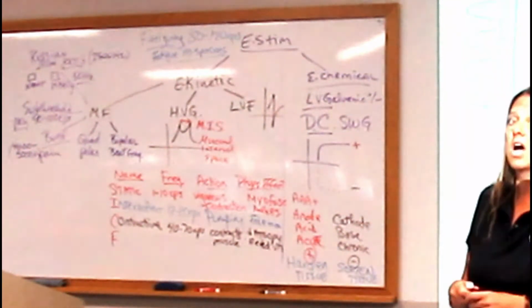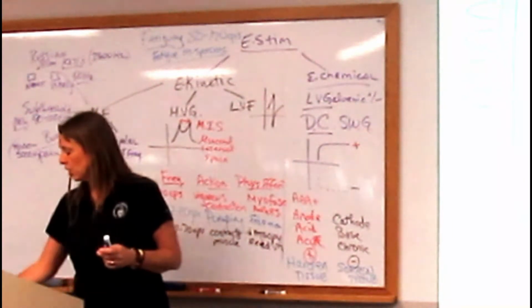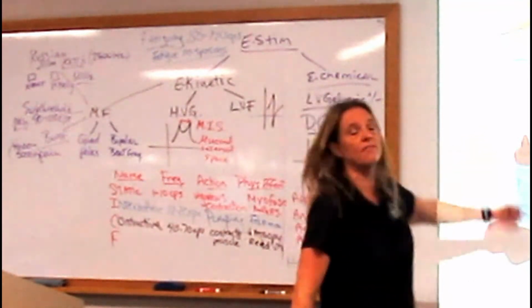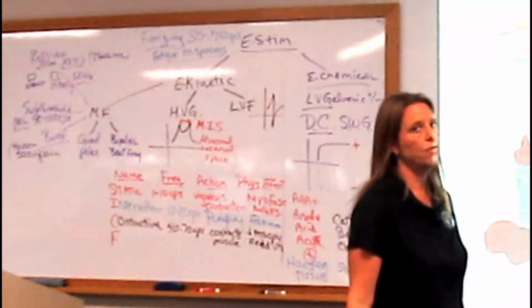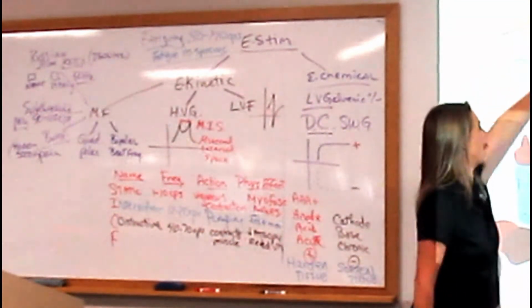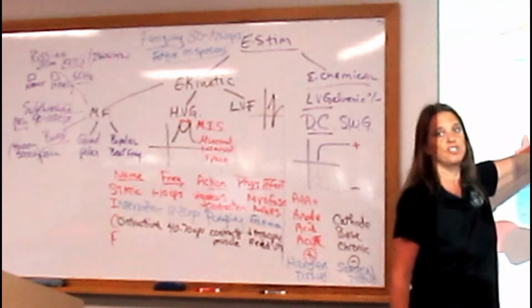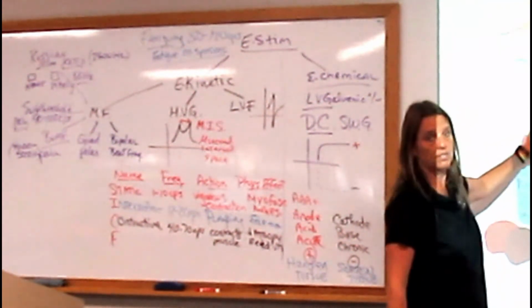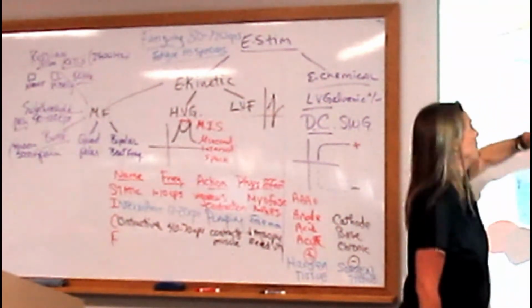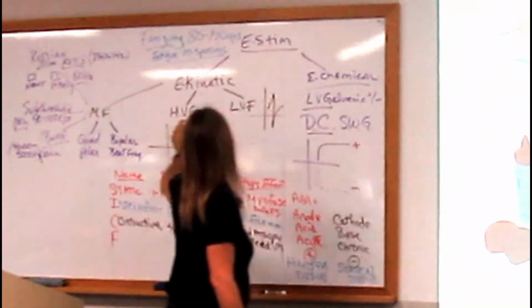The last thing I want to talk about is pad placement. Now, with pads, you have to make sure that you have used the correct pads and the correct size. So up here I've done just a real quick overview of the pad placement. But basically, what you want to do, like in this case here, we have 2 leads, and this particular set of leads right here is channel number 2. This particular set of leads is channel number 1. This would be an example of doing two bipolar setups with a medium frequency.